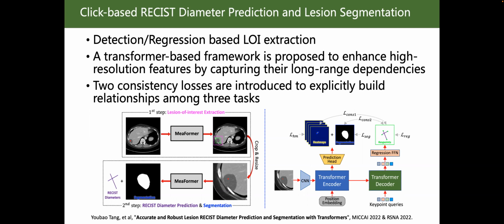The box is centered on the predicted box, and its width is 2 times the extent of the predicted box. As such, sufficient context information is preserved around the lesion of interest. Then the lesion of interest is cropped and resized to 256 by 256.